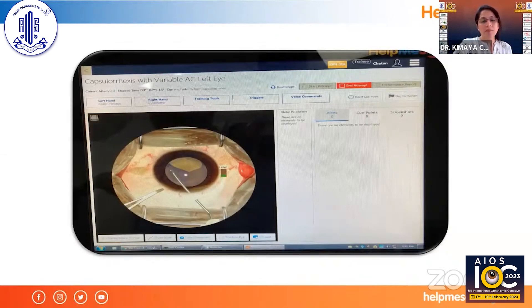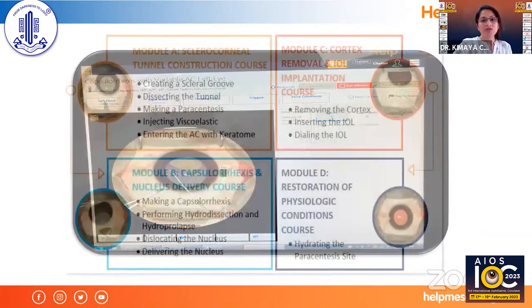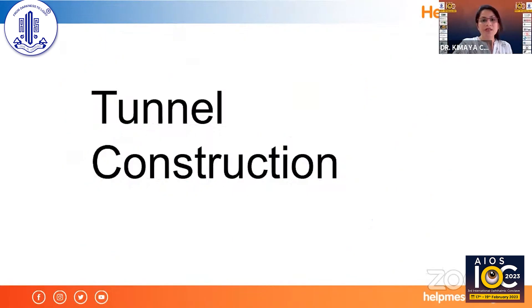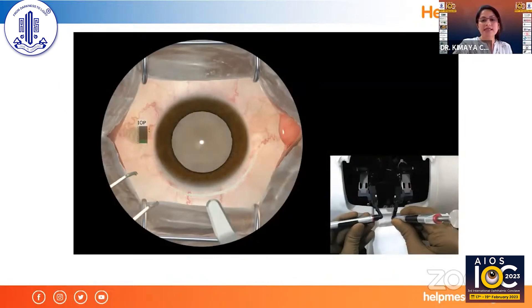This desktop is used to choose a particular surgical step and the instruments required for that step. These are the modules in which we teach SICS surgery on the simulator. I'll start with tunnel construction first.